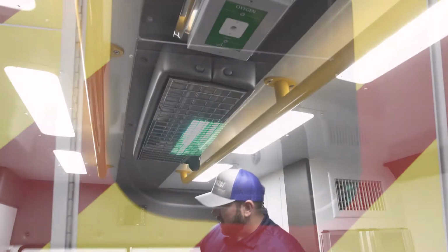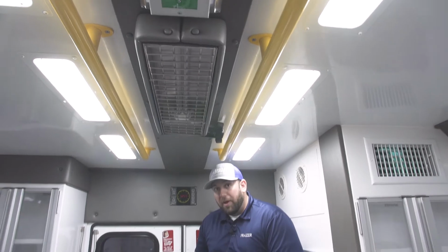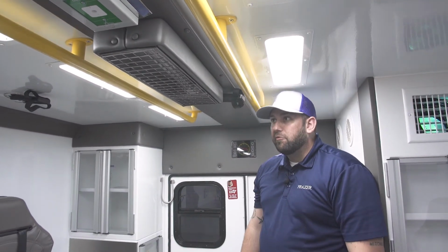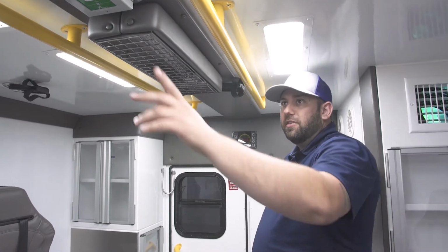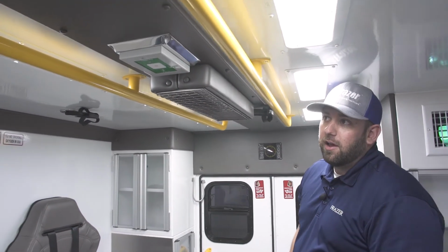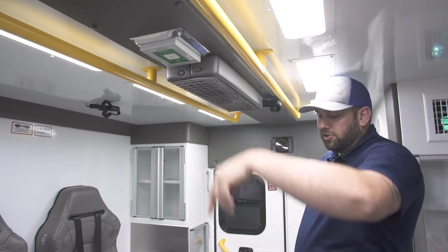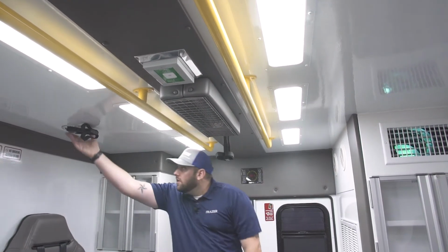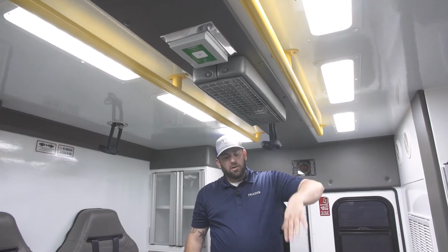And then in case somebody's walking by that doesn't know that this is activated, if they open up the door, it will actually shut this light off. So it's a safety feature that we've built in. Also in the ceiling, like I mentioned earlier, is the over patient oxygen line. We also have IV hangers in the ceiling over the squad bench area and over the patient as well.